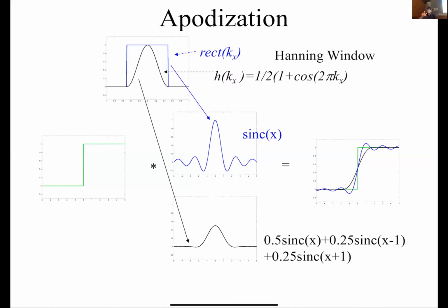So typically on scanners, there will be a little button you can press that says something like filter in K-space, and this is what that's for. But there's always a debate. Each site might have a different choice. Some radiologists will say, I don't want any filtering. I just want to see the image as it is, artifacts and all, because I know I can read through them. If you're in an area where maybe there's not so much expertise, then maybe you would want to turn on the filter, because maybe there's not enough medical expertise at that site. Okay.